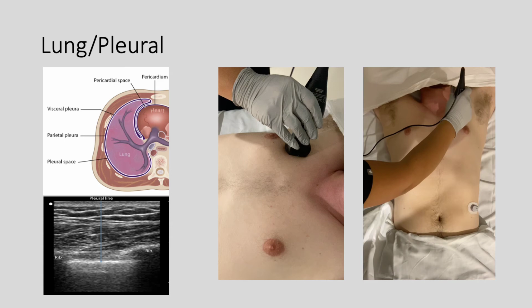The lungs and the inside of the thoracic cavity have a pleural lining. As the lungs expand, the visceral and parietal pleural surfaces slide past each other. The fluid between the two surfaces acts as a lubricant to allow lung expansion during inspiration. The direction of the sliding of the visceral and parietal pleural lines is then reversed at expiration when the lung returns to normal end expiratory volume. This to and fro motion is detected by ultrasound and described as the sliding lung sign.